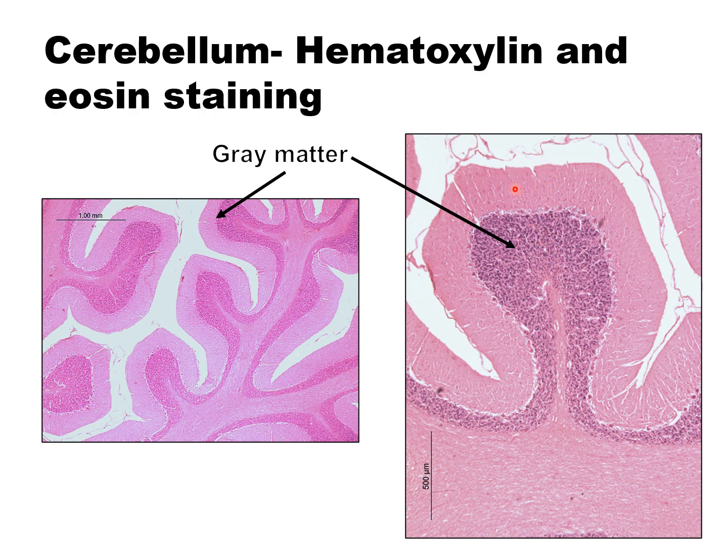So this is the gray matter of the cerebellum, and white matter of the cerebellum is here. Where the pointer is moving, this is the white matter of the cerebellum. The nerve fibers from the cerebellar cortex pass through the white matter.